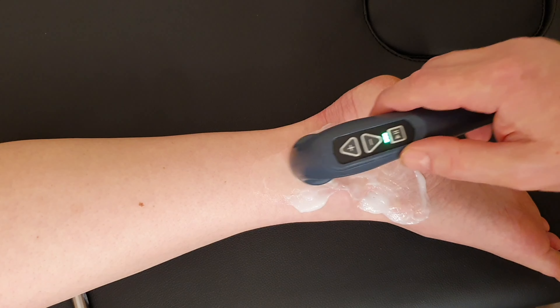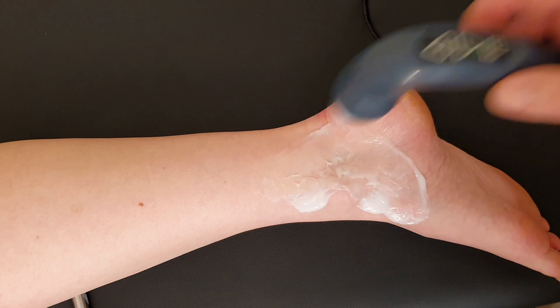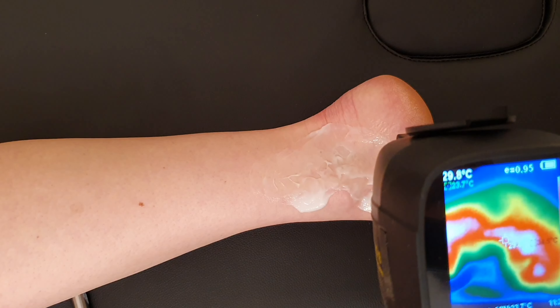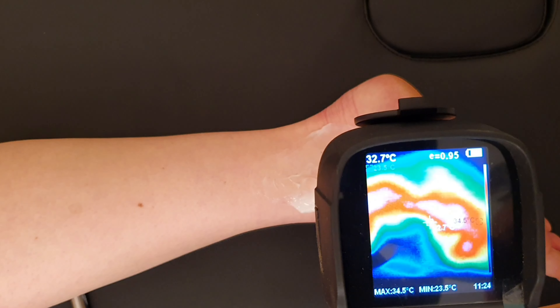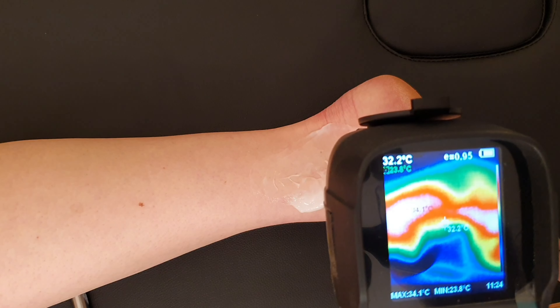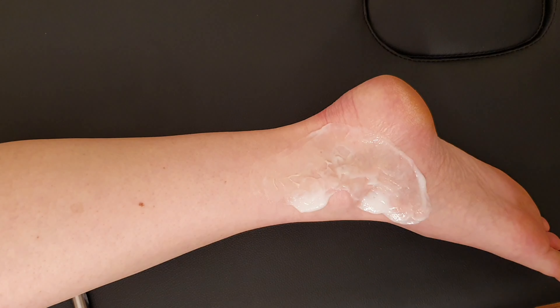At the end of the treatment, we'll bring the thermal camera back in and have a look at the temperature difference. You should see a marked temperature difference here on the soft tissues. You can see the C-shaped pattern I've been making, and at its hottest it's about 34 degrees Celsius — overall around 32 degrees. That's a good increase in temperature, good for chronic problems in and around the tibialis posterior.